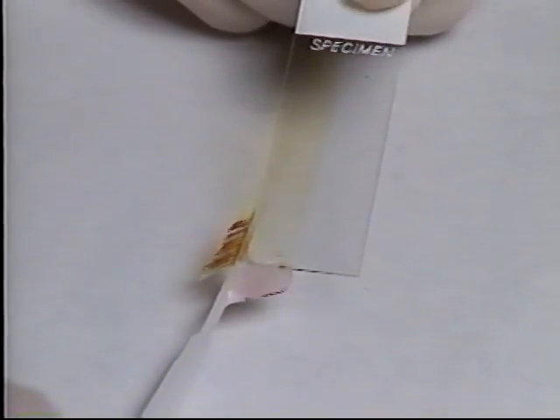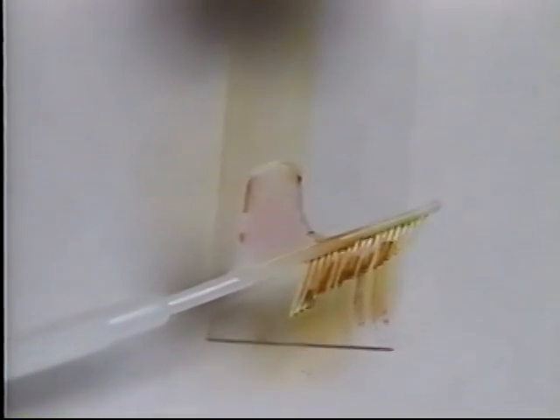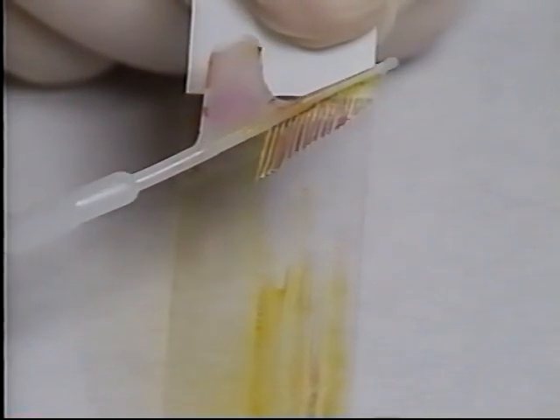Transferring is as important as harvesting the cells. Using CellSweep, the slides are uniform and the CellSweep system is almost always reproducible.